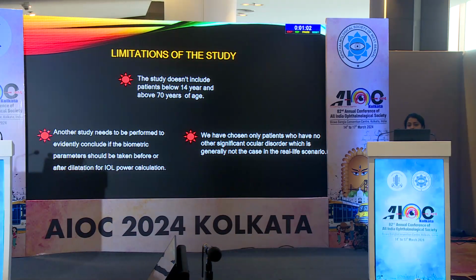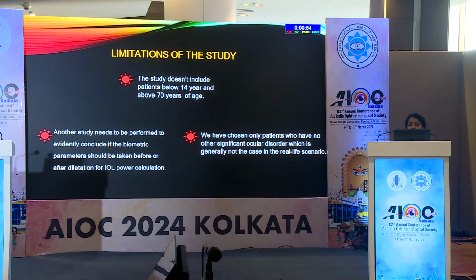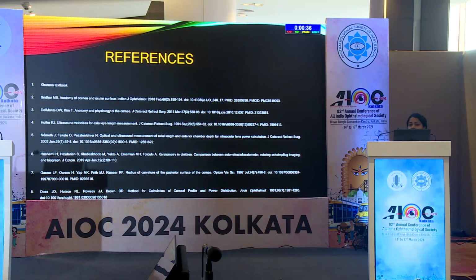The limitation of my study was firstly the age group. We excluded patients less than 14 and above 70 years. And secondly, another study has to be performed to conclude if the biometric parameters should be taken before or after dilatation whenever we call a patient to the OPD for IOL calculation. Third, we have chosen only patients who have no other significant ocular disorder, which is not the case in real life scenario. These are my references.